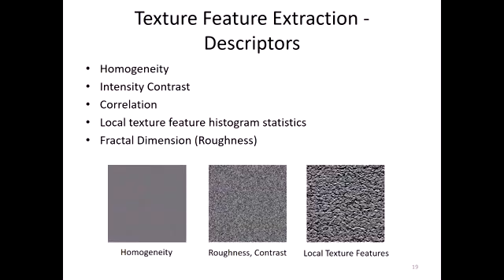Okay, so texture feature extraction of the descriptors. Somebody asked me, is this texture in the standard concept of a texture that you would feel, or is this some computer thing that you guys would come up with, a technical term? I said, no, it's the same thing. A very good description of a texture is that a texture describes the surface of a feature, and the descriptors say what that surface of the feature looks like. These methods are widely used in research of this kind to describe the features.